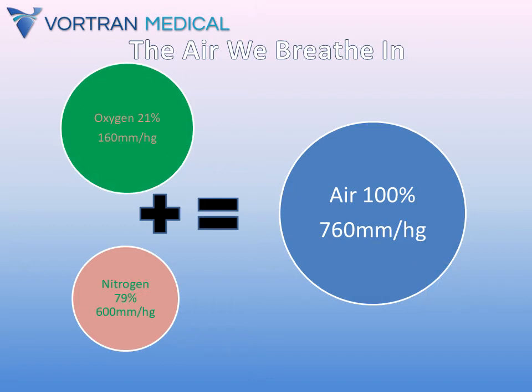Although we only use 5% of the oxygen we breathe, it is the gas that sustains life. The body needs oxygen, and unlike carbon dioxide, the body cannot tolerate inadequate levels of oxygen. Moving forward, remember that your primary objective is to keep the body bathed with oxygen.